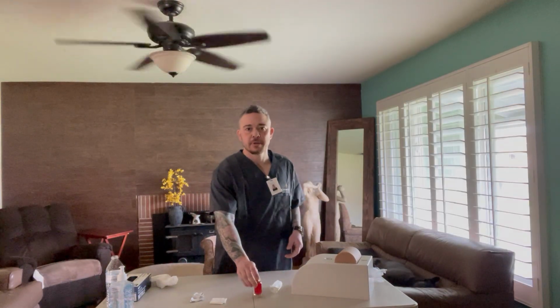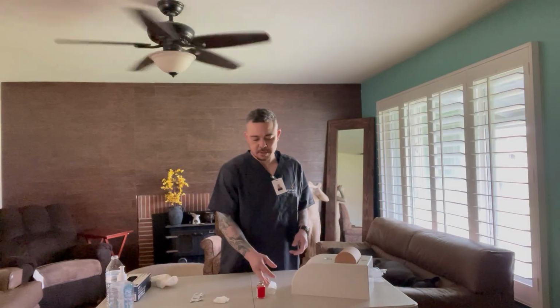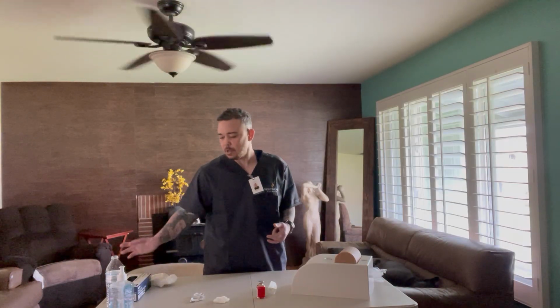First thing I want to make sure is that I have all my supplies, which is the heparin, the medication, gauze, alcohol swabs, my 1 milliliter syringe with a 25 by 5/8 needle, hand sanitizer, my needle receptacle, which is a water bottle for the purpose of the video because I don't have a receptacle, my gloves, and my patient.